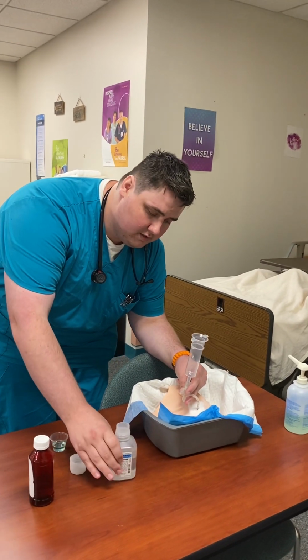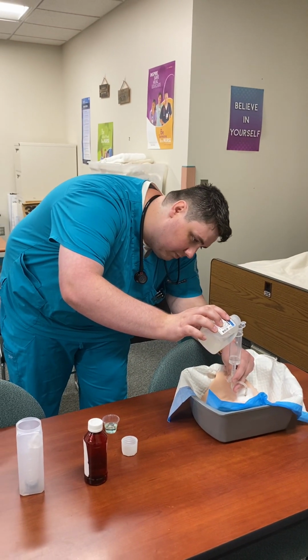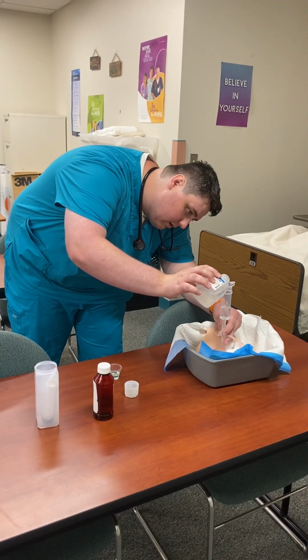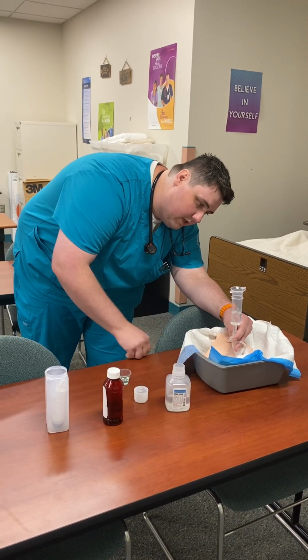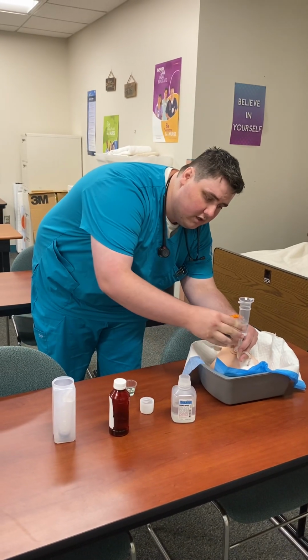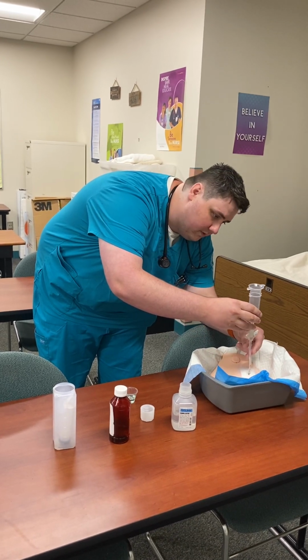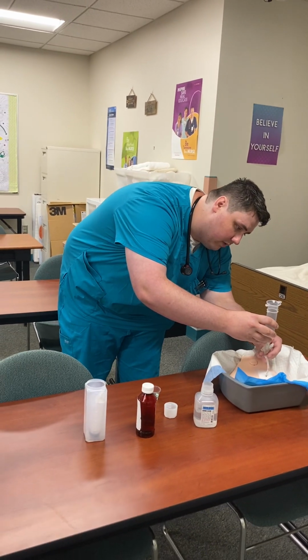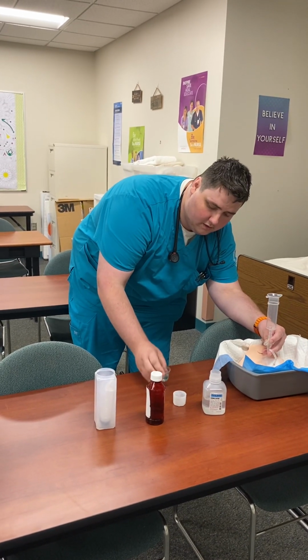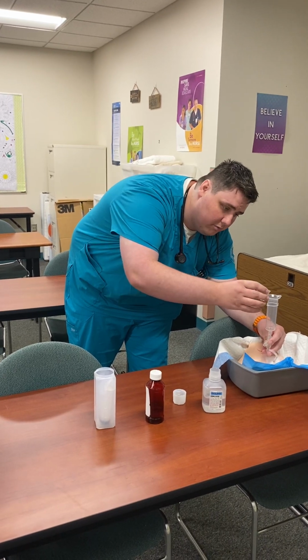But before we do this, we're going to flush the tubing to make sure that there are no particulates that will mess up our count. Anywhere between 30 and 60 milliliters is the typical amount used for flushing. So we're going to do 30 in this case. So you're going to flush and infuse the water through. Before it ends, you will clamp back so that you have an area of recourse so the air doesn't go in or out. Then you apply your med.